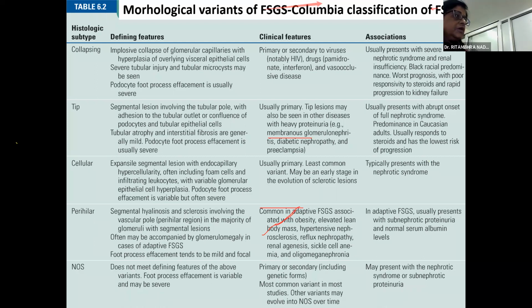And foremost, though it is difficult to say, in situations where we don't have electron microscopy, we may miss certain conditions like Alport syndrome presenting as FSGS. So in that scenario, what is recommended is that if the patient is not responding as you expect for FSGS, you may refer the block for electron microscopy, as EM can also be done from paraffin-embedded tissue submitted for light microscopy.